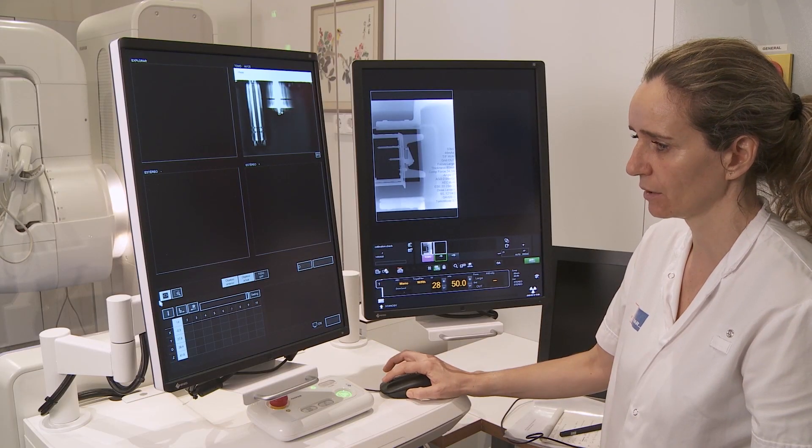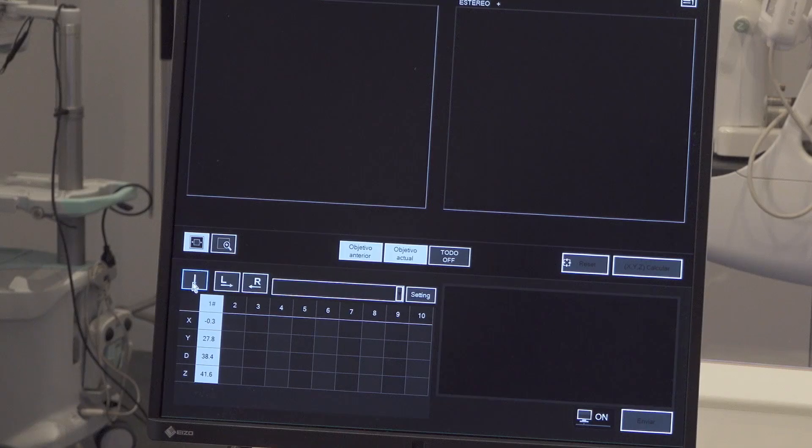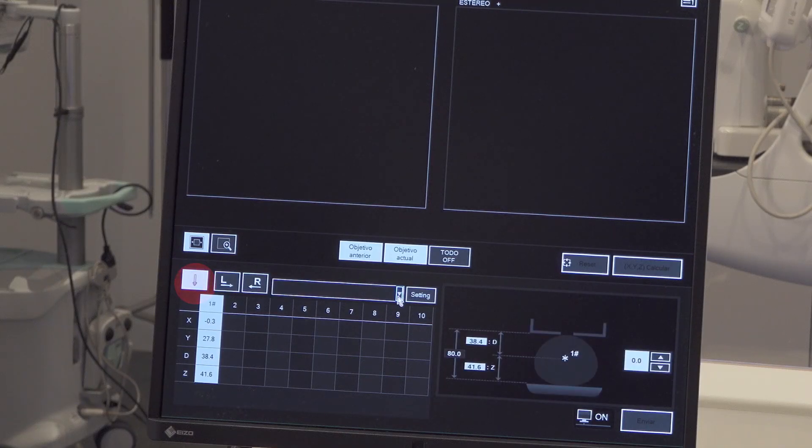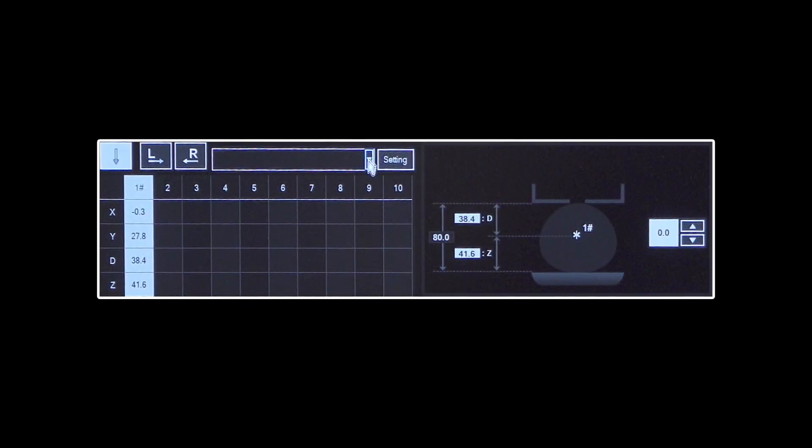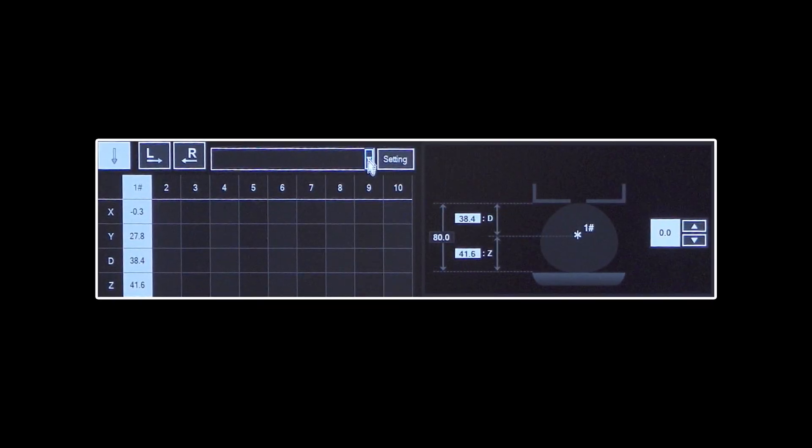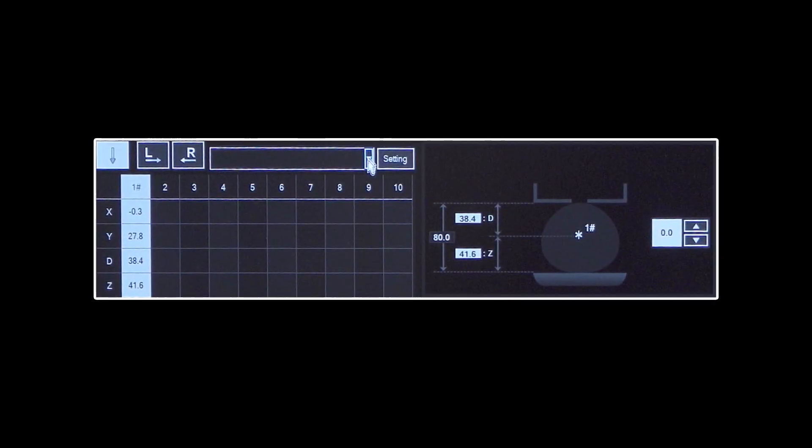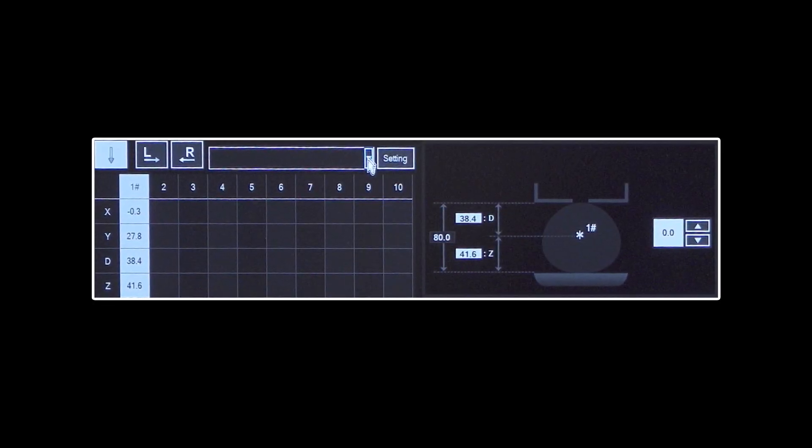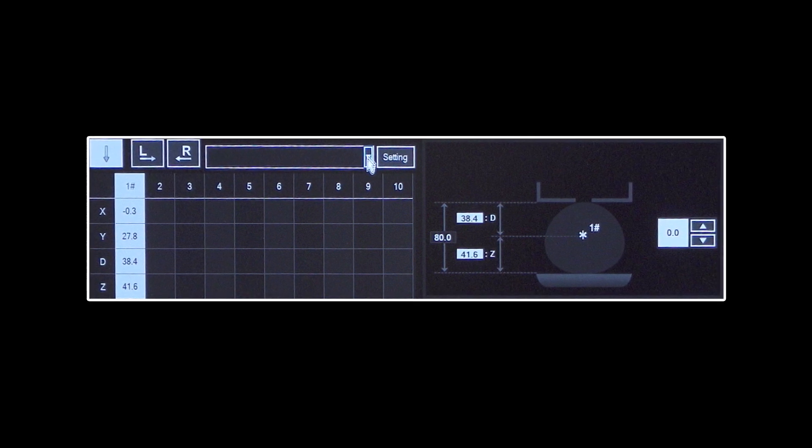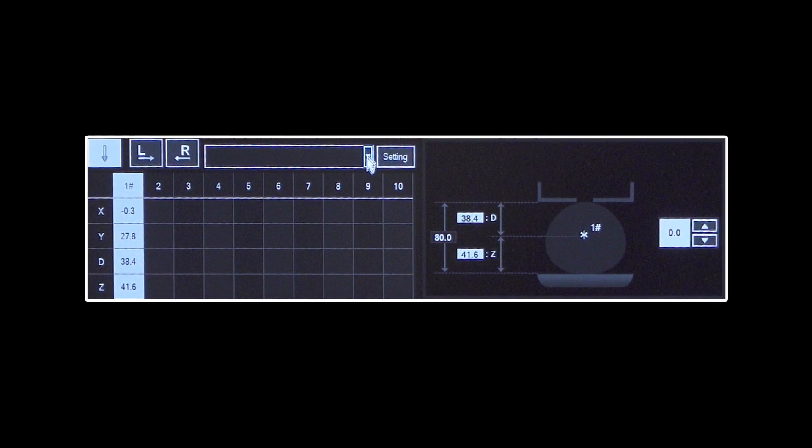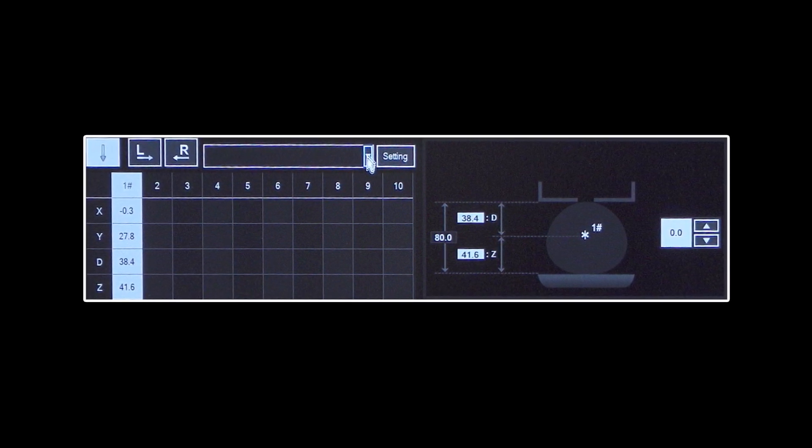Select vertical approach. Observe the breast pictogram indications: breast thickness, target distance to breast support and skin, as well as the target coordinates X, Y, and Z.